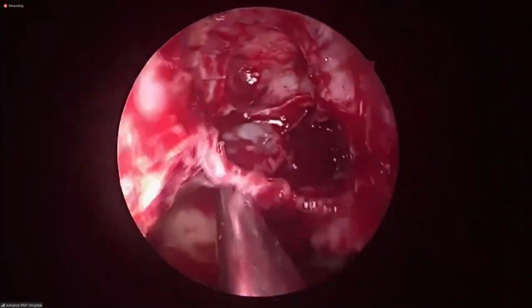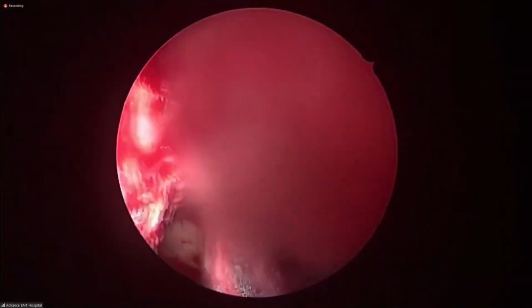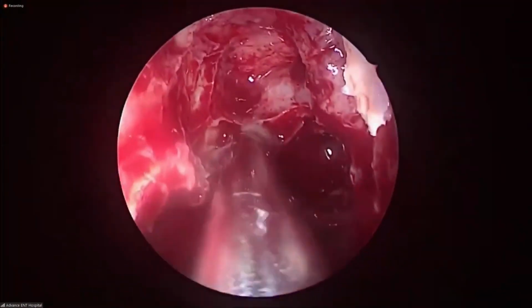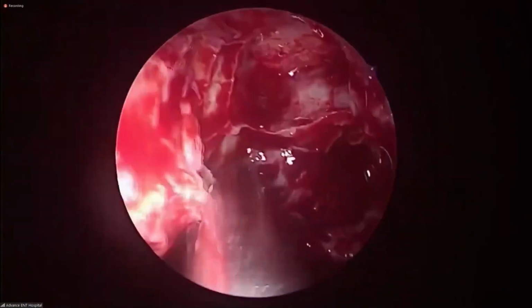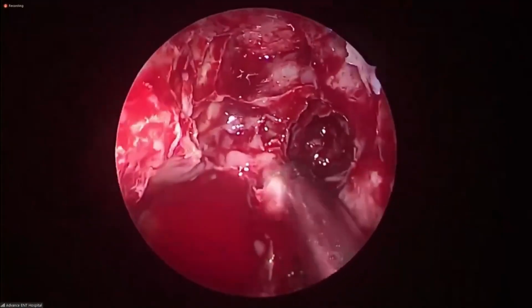Is that a Haller cell, sir? Yeah, could be.